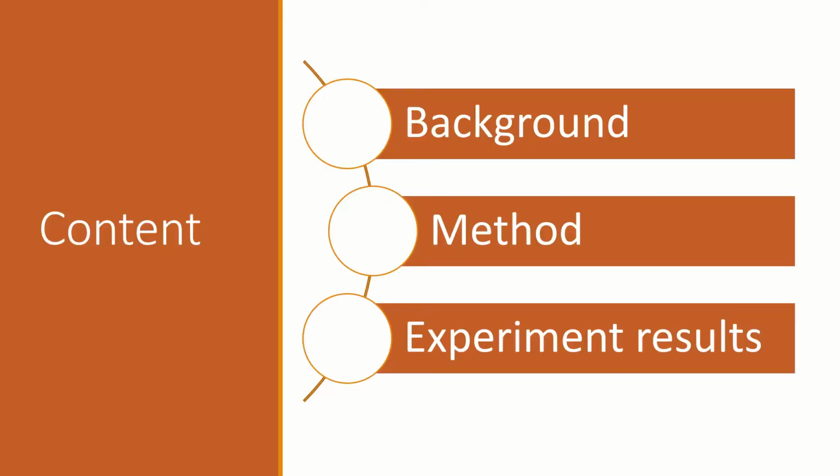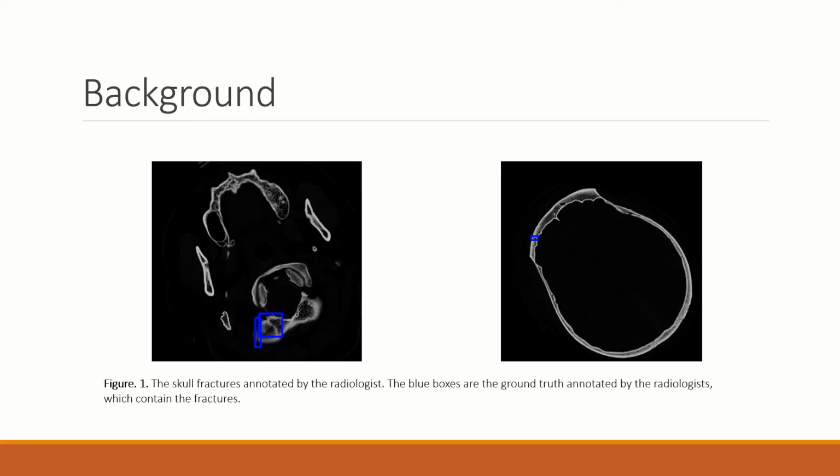This video will follow the main framework of our paper. Skull fractures following head trauma may bring several complications and cause epidural hematomas. Therefore, it is of great significance to locate the fractures in time. However, it is not an easy task.